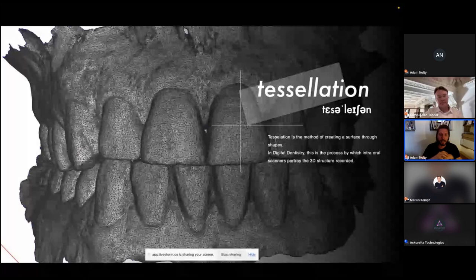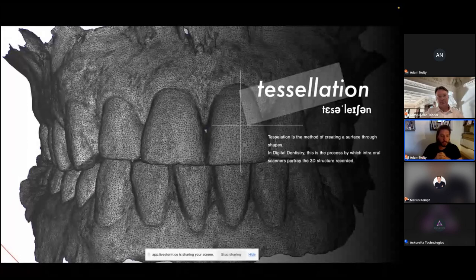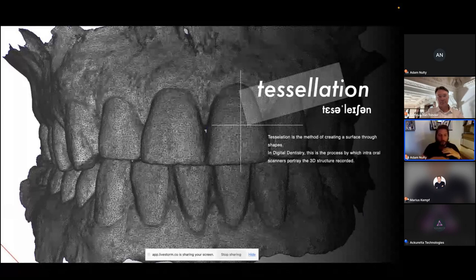It is a really easy way that I usually describe what an STL is. Imagine a piece of paper that we can crumple up and fold up into any shape that we like. If we fold it up, it's still a piece of paper, just folded up into a different shape. Now, that might be a 3D shape, but it's not a solid structure. It might be crumpled like a mountain, but underneath is hollow. And that's what an STL is.